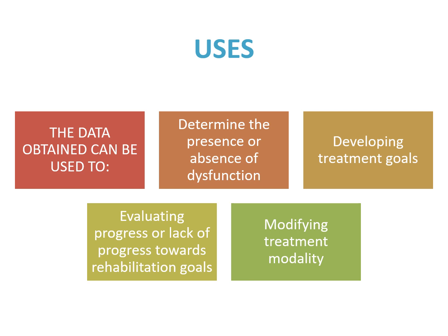So basically it will help us in understanding the prognosis of the patient, whether he is improving or not improving, whether he needs any changes or he doesn't need any changes. So these readings will also tell you about the improvement or the prognosis of the patient. So depending on that, you can modify the treatment.